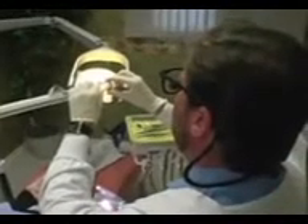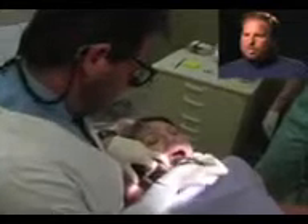The first thing I'm going to do is numb up Sheila. We're going to use lidocaine two percent, and we have a painless injection with a thin needle. We'll also check the X-ray so we know what we're doing.